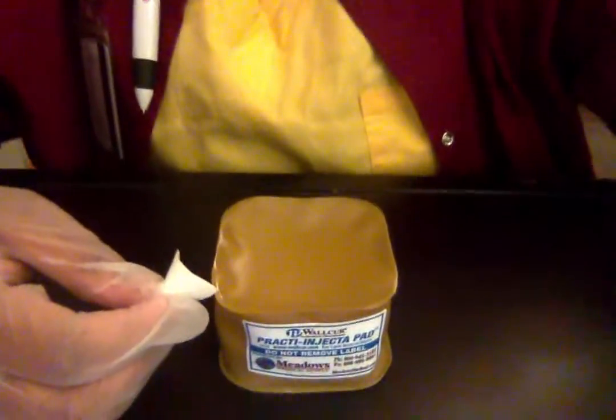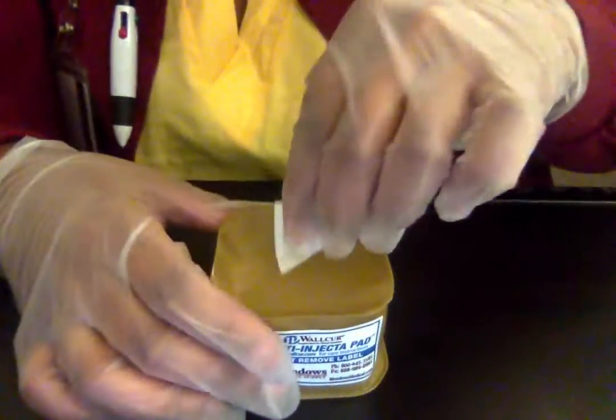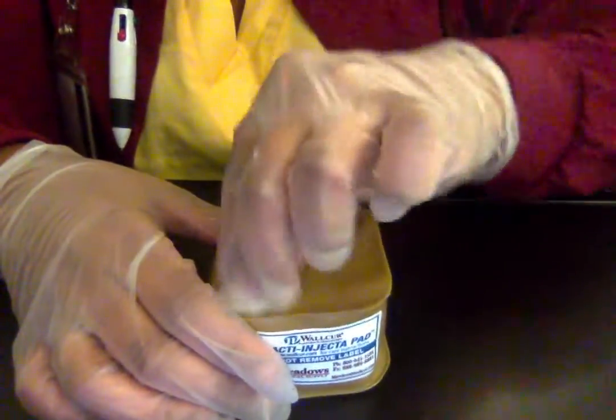Now that I've found that deltoid, to find a place to give the injection for the deltoid, you're going to find the acromion process, which is this part just right over your shoulder. So I would find the acromion process and then give my V, and I would just give it right in the middle of that. So I found that spot on my patient, and now I know where to go. So now we're going to just clean that site from inner to outer.